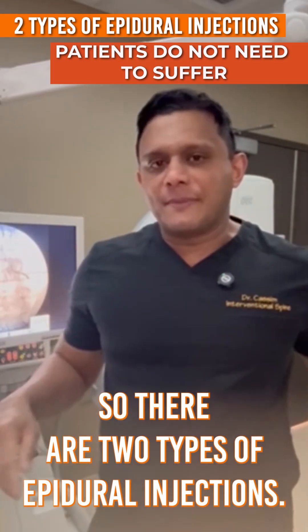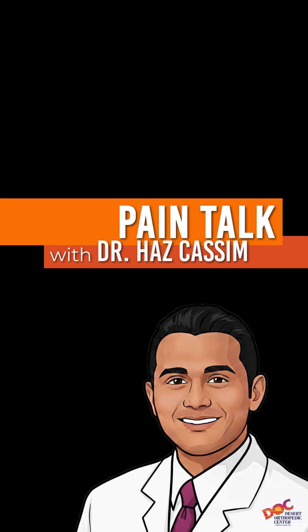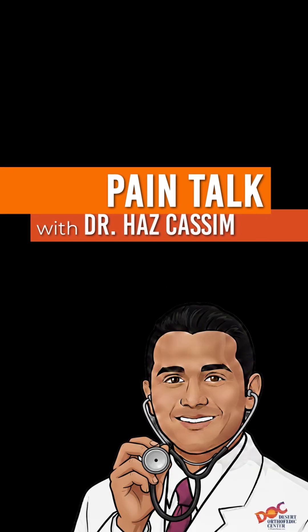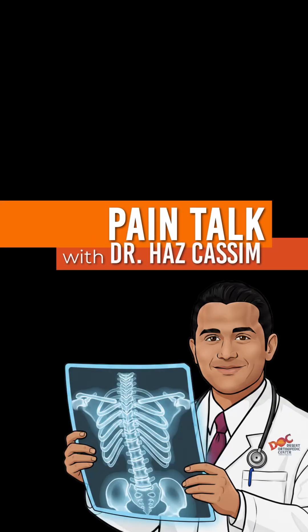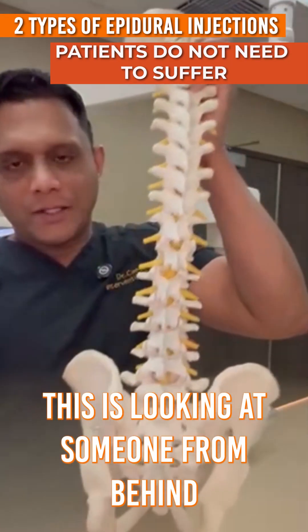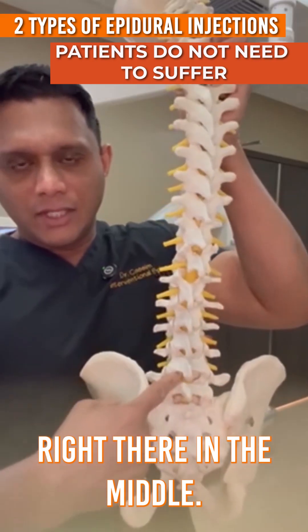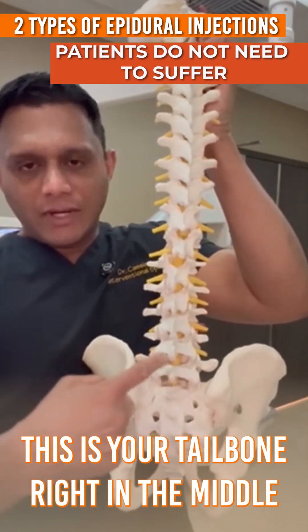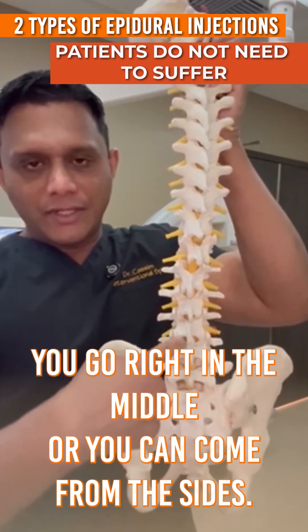There are two types of epidural injections. Looking at somebody from behind, right there in the middle — this is the back, this is the tailbone. Right in the middle, it's called interlaminar — you go right in the middle.